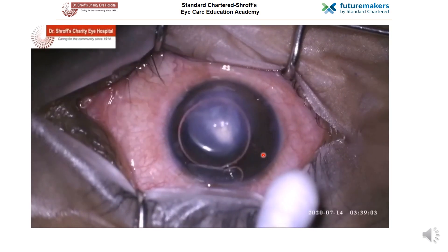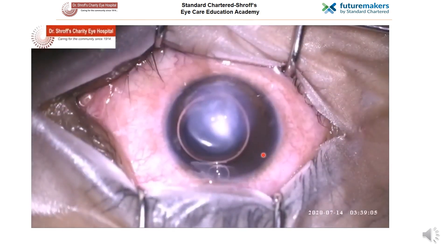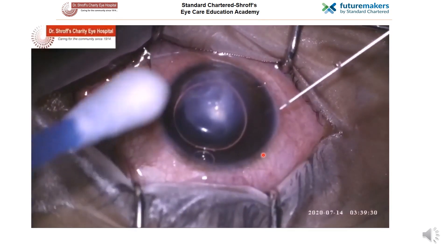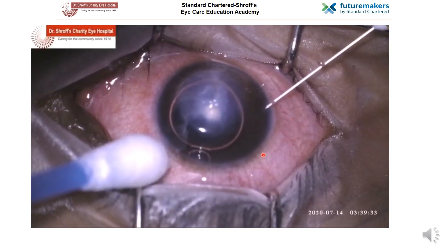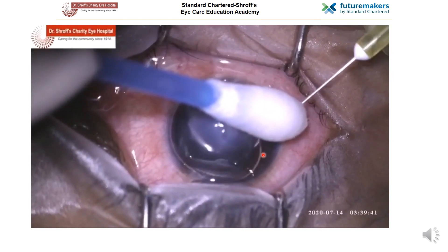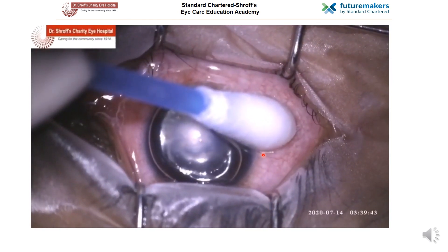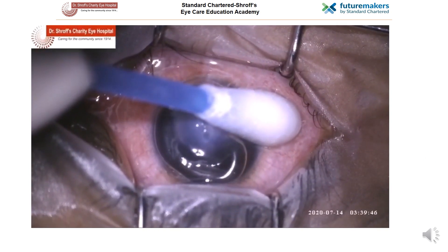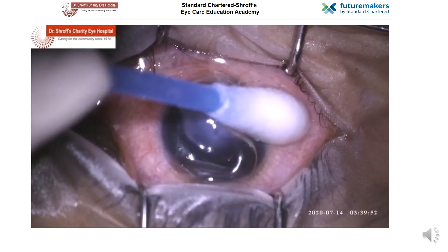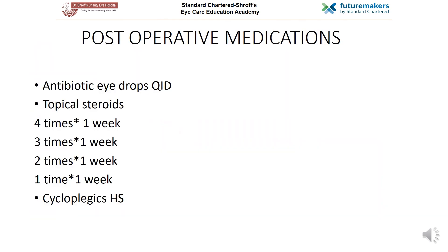In certain cases, if sufficient air has not been injected in the first attempt, a repeat injection from the same site can be attempted, as demonstrated in the video. Post-operatively, the patient is started on antibiotic eye drops 4 times a day, topical steroids in tapering doses, and cycloplegic eye drops.